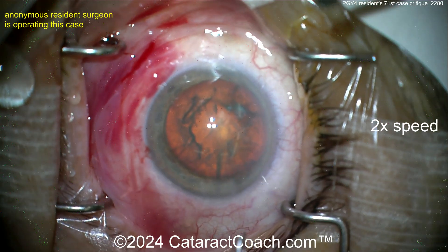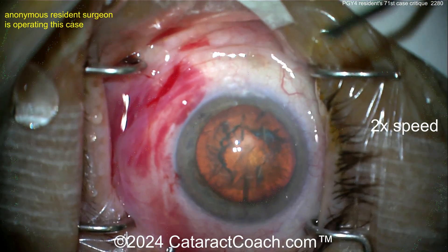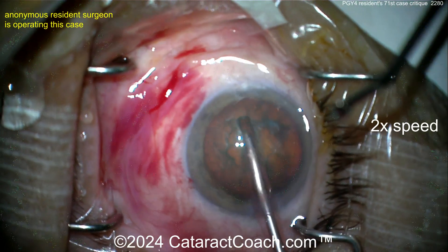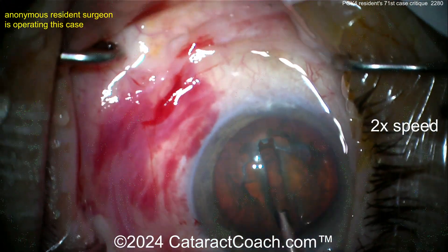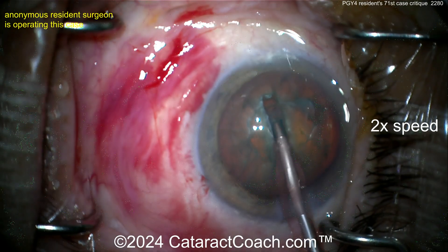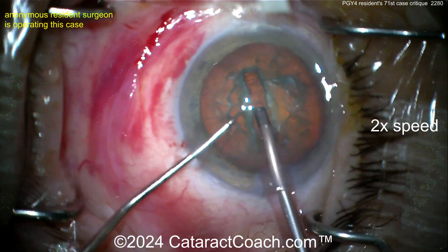Here comes the phaco approach. Adjust the sleeve — I like that, take your time. There's a free CataractCoach PDF book on cataractcoach.com you can download to any device. Great groove down the middle — looks pretty good. Watch the light reflex on the cornea; keep those Purkinje images in the center of the eye. See how the eye is being pushed out of primary — those three lights should be in the center of the cornea at all times.